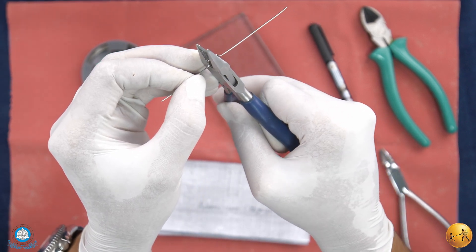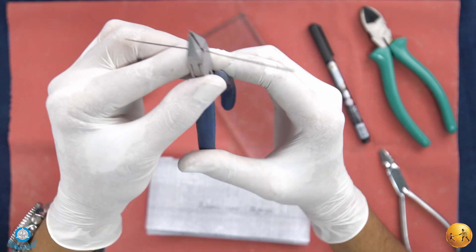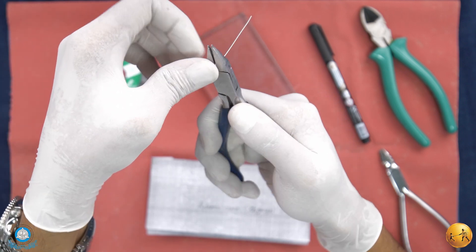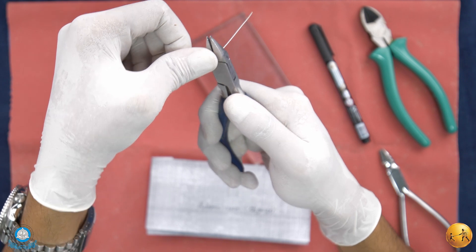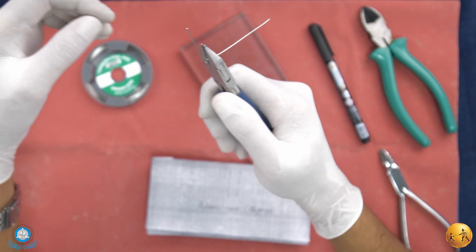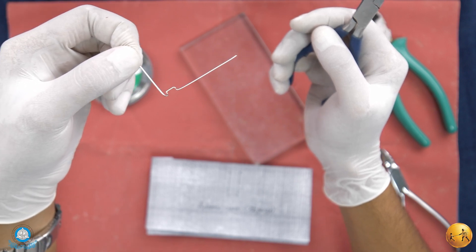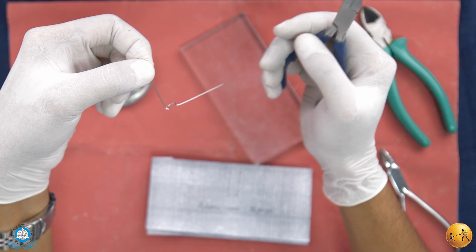Once this is done, we will hold the wire bending at the edge of the plier — hold it like this. With our thumb, we will give a downward bend, keeping the pressure constant over the wire, and then just lift the wire upwards. Now we have an arrowhead on this side.